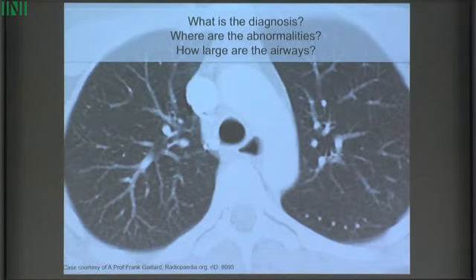So we've already seen quite a lot of different medical imaging applications today. And in general, we see that there's many different questions we would like to ask for a particular type of image. So for example, we might want to ask what is the diagnosis of the entire image, or we might want to detect some abnormalities, we just want to know their locations, or we might want to segment a more accurate structure to be able to measure it. Like in this case, in the chest CT image, maybe measure the airways, or I think we've also seen the prostate today and a few others.